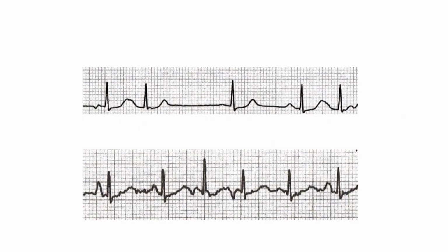If you see this ECG, this is one P wave here, then this is one P wave, then this is one P wave. You can see the P wave morphology is different in all the complexes. In the second ECG also, this is a P wave, this is a P wave, this is an inverted P, this is also an inverted P. Again, this is an upright P, this is a tall P. So again, various P wave morphologies. So this is multifocal atrial rhythm.